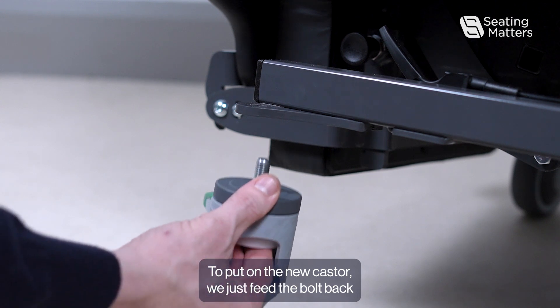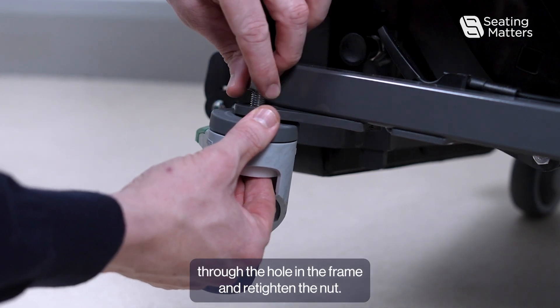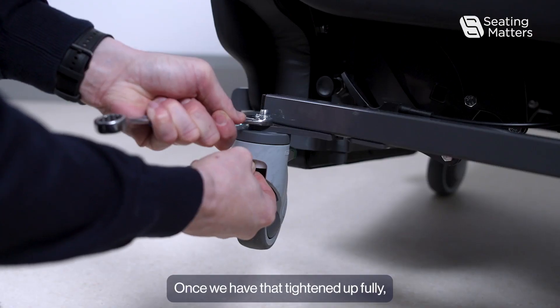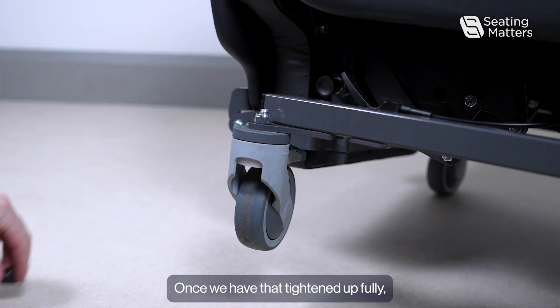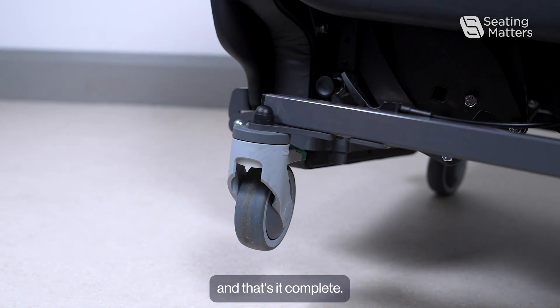To put on the new caster, we just feed the bolt back through the hole in the frame and re-tighten the nut. Once we have that tightened up fully, we can just put the nut cover back on. And that's it complete.